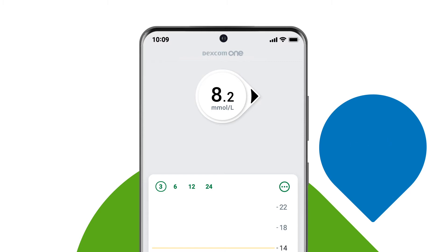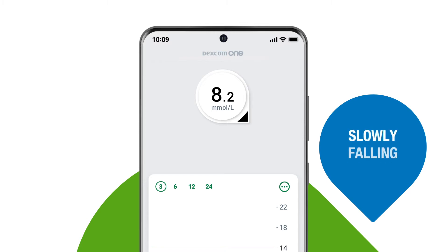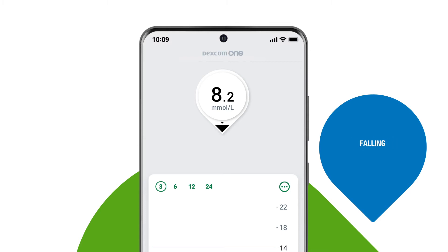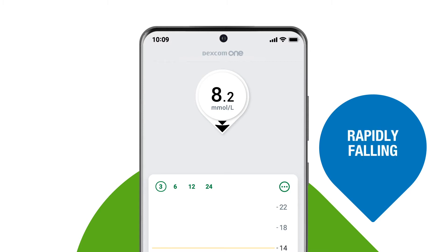An arrow angled down means you are slowly falling. One arrow pointing down means you are falling steadily. And two arrows pointing down means your glucose is rapidly falling.